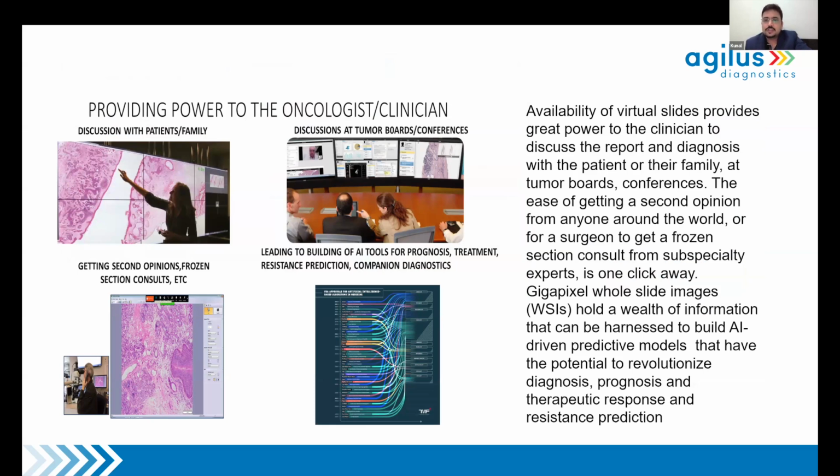The availability of virtual slides provides great power to clinicians to discuss the reports also with patients and their family, also discussions in tumor boards and conferences. Also, there is an ease of getting a second opinion from anyone around the world. You might have a specialist sitting in USA and you might want to show them the case, and they can analyze that in no time and give you an opinion. Also, for a surgeon to get a frozen section consult from subspecialty experts, it's just one click away.